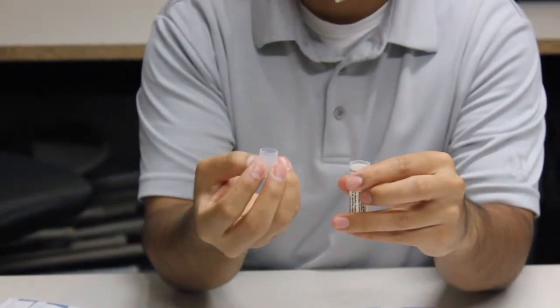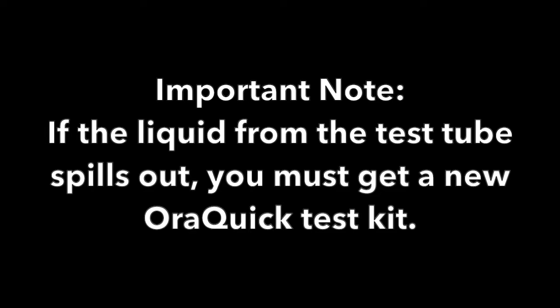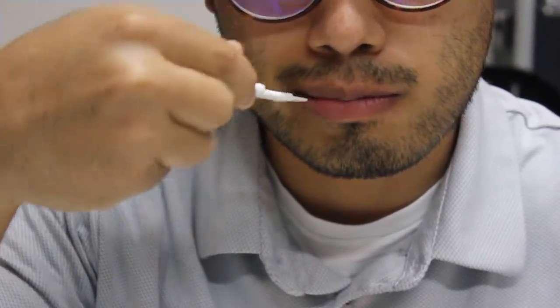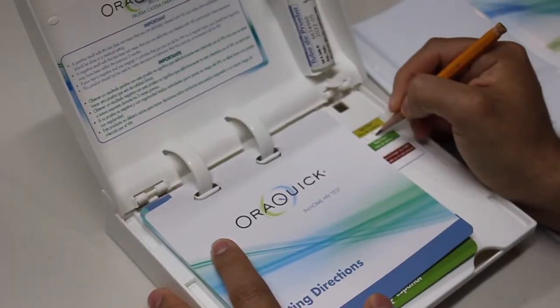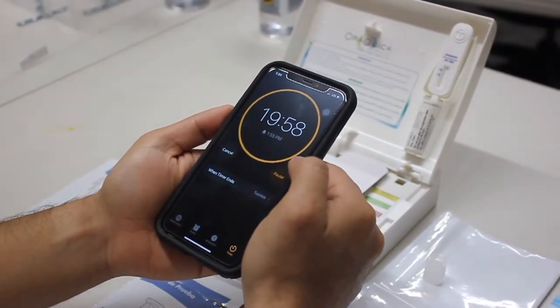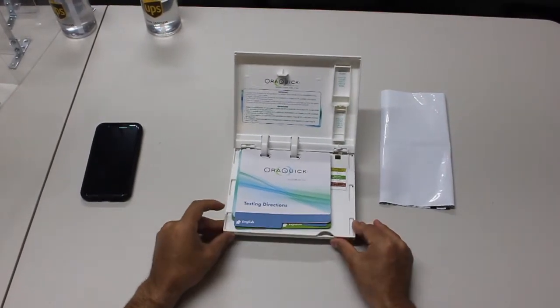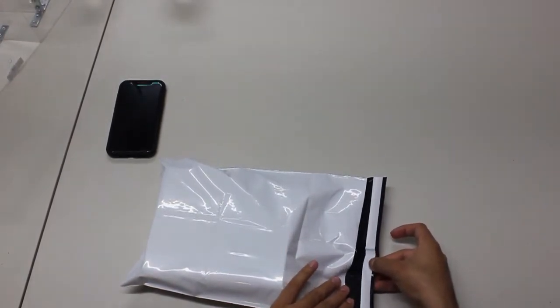Here is how to use the OraQuick test. First, carefully open the test tube by popping off the top and place it in the test tube holder upright. If the liquid from the test tube spills, you will need to get a new test kit. Next, take the test stick out and gently swipe the stick along your upper gums once and your lower gums once. Next, place the test stick directly inside the test tube, swab down. Leave the test stick in the test tube for 20 minutes. Set your timer for 20 minutes and be sure to check back before 40 minutes has passed. If you wait more than 40 minutes after taking the test, the test stick may show inaccurate results. Once you're done, put all contents in the bag. This strip can be taken off to seal the bag for confidentiality.